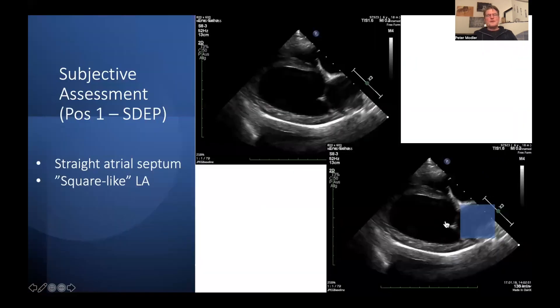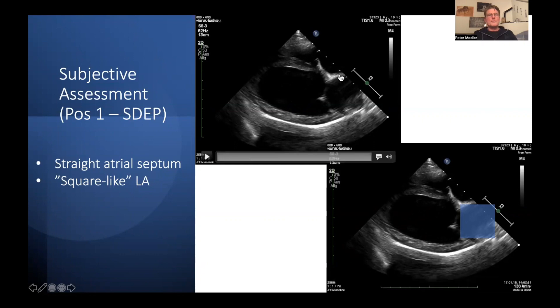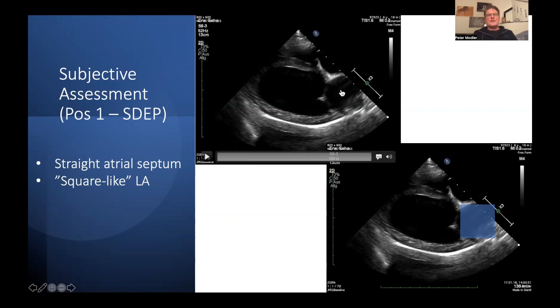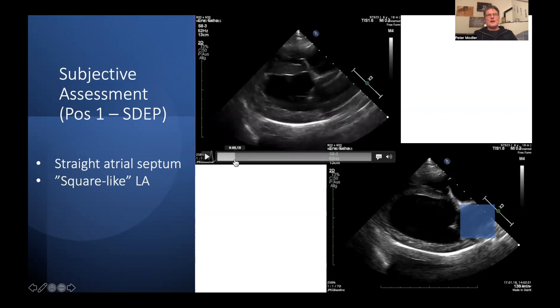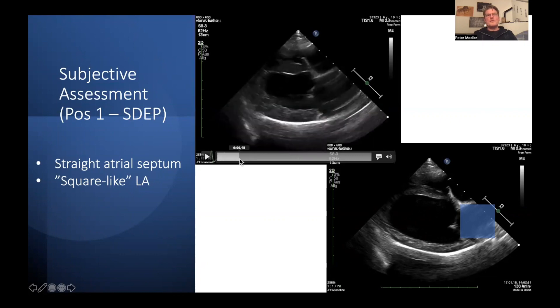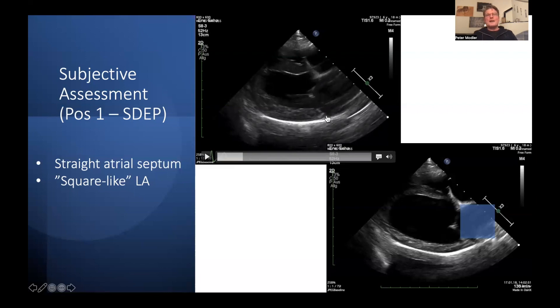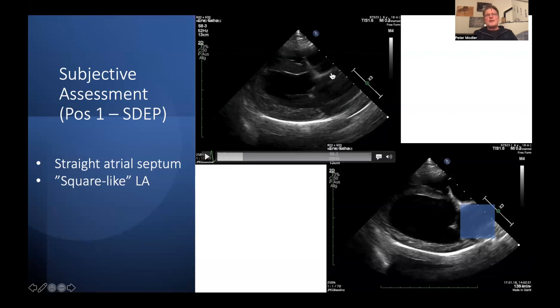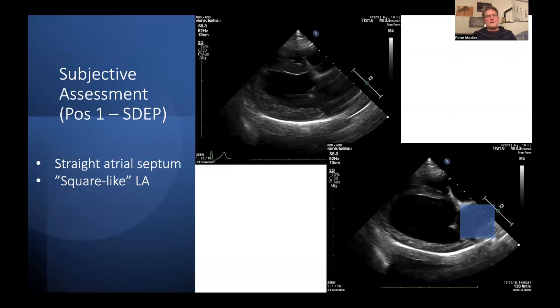First of all, I can only encourage you to look at the right-sided four-chamber view — the so-called BRICK position, or Position 1 of the ESTER protocol. This is the view you want to get: your left atrium here, left ventricle there, right atrium here, and right ventricle here. Scroll through the video and find the last frame before mitral valve opening. On this image you want a roughly square-shaped left atrium with a straight inter-atrial septum.